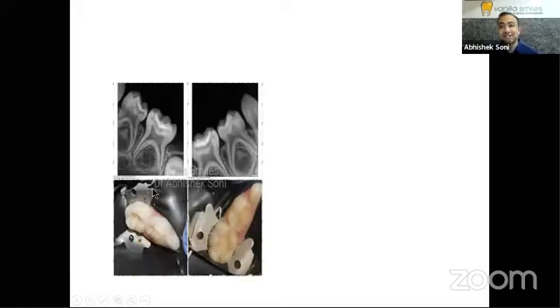So let's look at a clinical scenario. This was a child who was treated under general anesthesia, under strict asepsis, and under rubber dam. You can see these restorations which are failing. You can see a lot of secondary cavity under the restorations. And we started with non-selective removal of the carious tissue because we wanted to be definitive, since the child was being treated under general anesthesia.